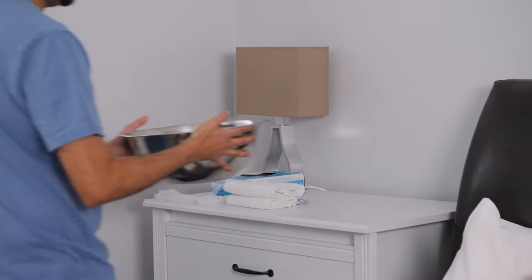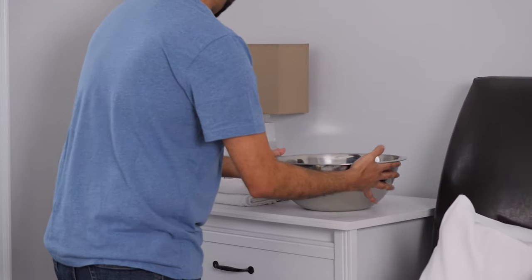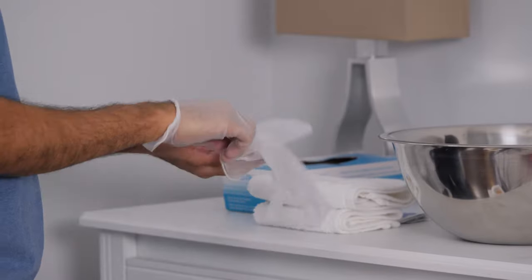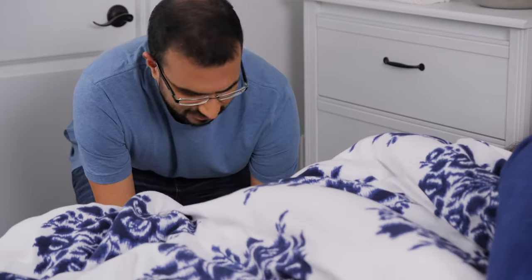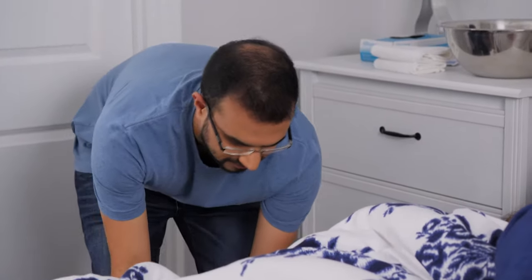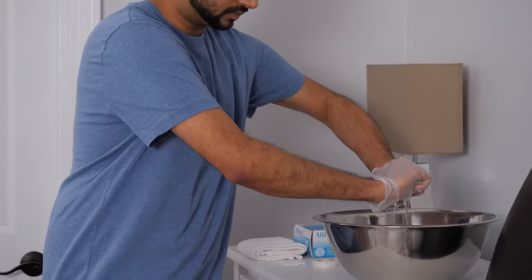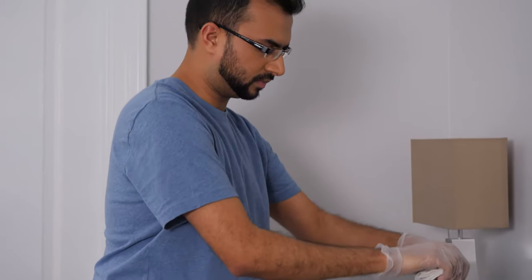You'll need disposable gloves, soapy and clean water, washcloths and towels, gauze, and a waterproof pad. Cleaning around the catheter is often the most uncomfortable part of the process for both of you, but doing this daily helps prevent infections and trips to the hospital. First, empty the bag so it doesn't pull on the tube while you work.